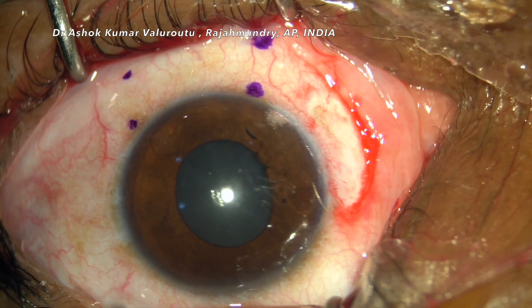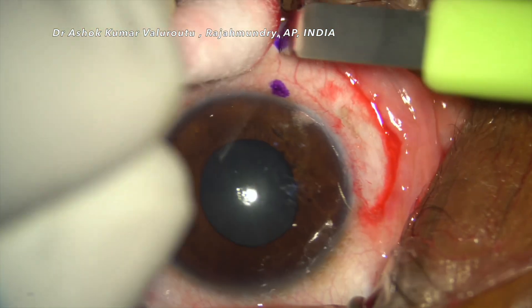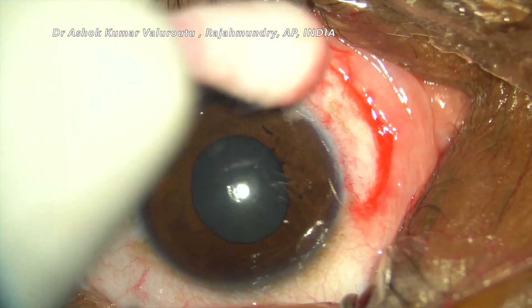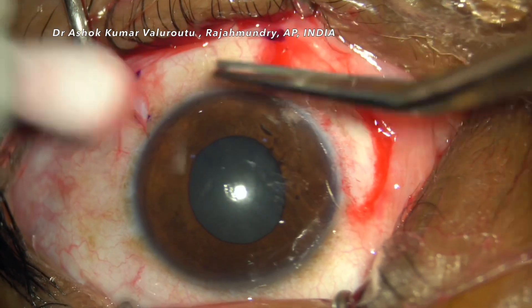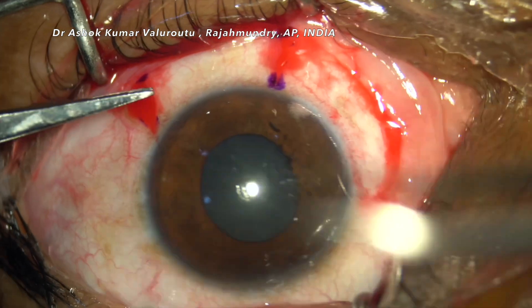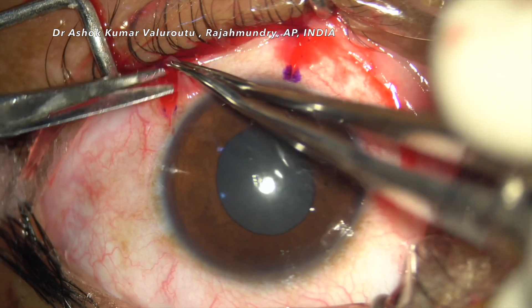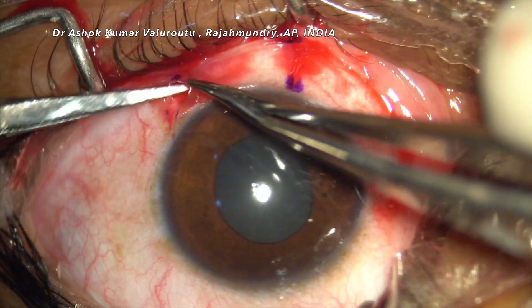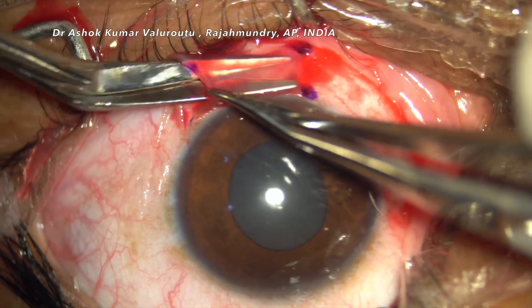Once the marking is done, with the use of a crescent blade small incisions are given. Care should be taken not to make the incision deep so that the underlying Tenon's is also incised — only the conjunctiva should be incised. While passing a Vannas blade for blunt dissection under the conjunctiva, we should be able to see our Vannas blade, which is an indirect sign that we are not dissecting any of the Tenon's, because conjunctiva is relatively transparent.